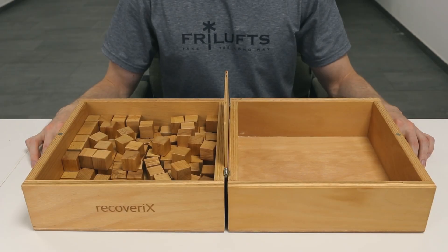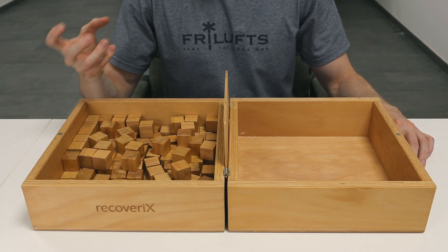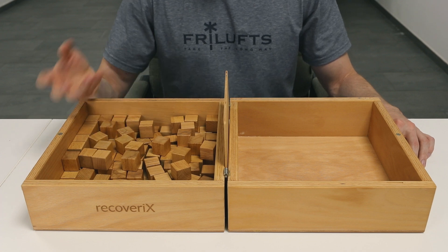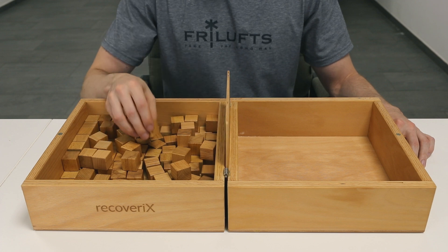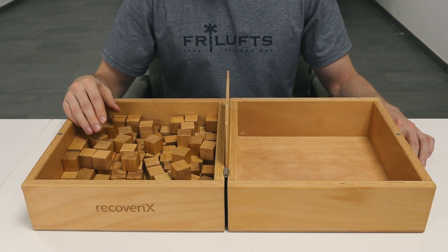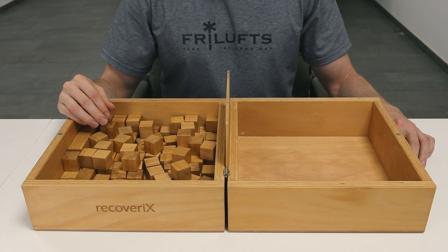Sometimes patients may not be able to perform the Box and Block Test unilaterally — meaning with just one hand — without any help from their healthy side. In these cases, the score is zero. We recommend always performing the standardized Box and Block Test even if the person is not able to complete it. Additionally, you may also perform a modified version of the test. Here are some examples of situations which would require a modification.